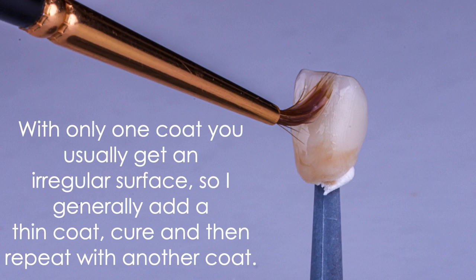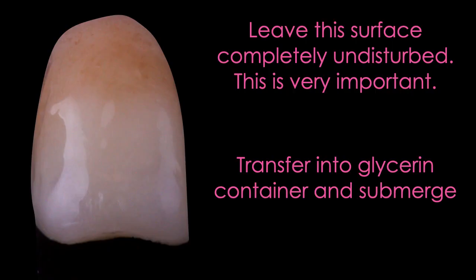The curing light you use here is very, very important. It's also important to leave the surface completely undisturbed — try not to touch it at all. If I'm using a crown, I'll have it on a peg so I don't have to manipulate it with my fingers. After curing with the chairside curing light, I'm going to transfer it into a glycerin bath and put it back in my ODA Flash for the second half of the post cure.